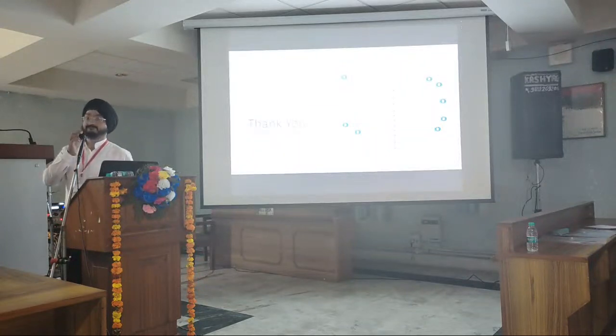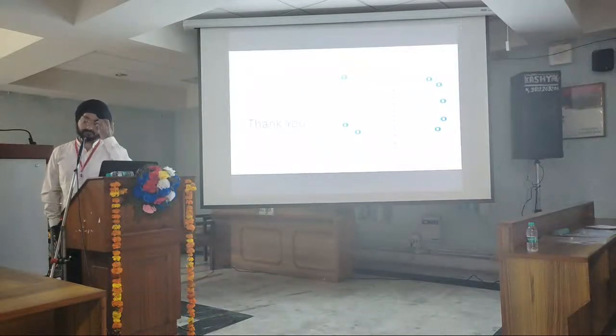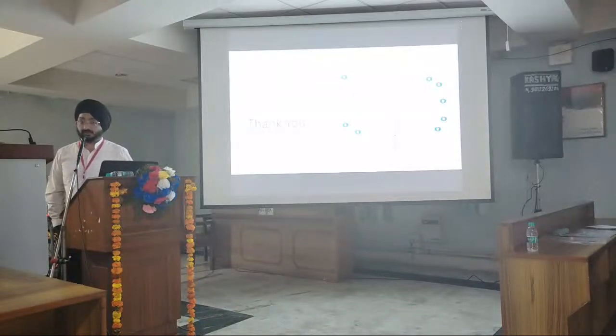The question was whether we should do it before biopsy. What I feel is that it is a modality primarily for metastatic workup, not for diagnosis. But in cases where the PSA is high but the rectal examination is normal, then of course we have to localize. So only in selected cases. That's where we started actually, DRE negative. That is its role. Otherwise, the main role is metastatic.